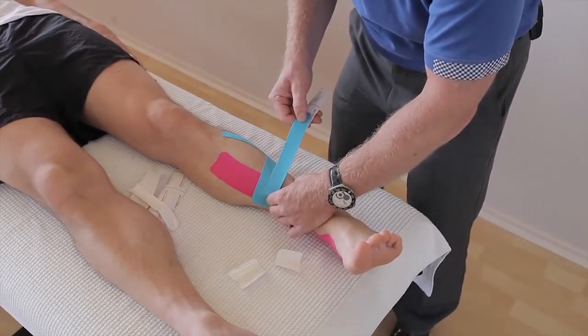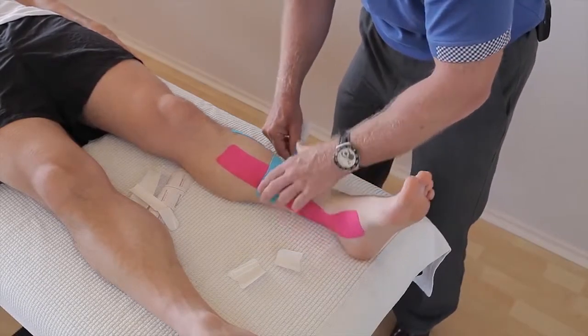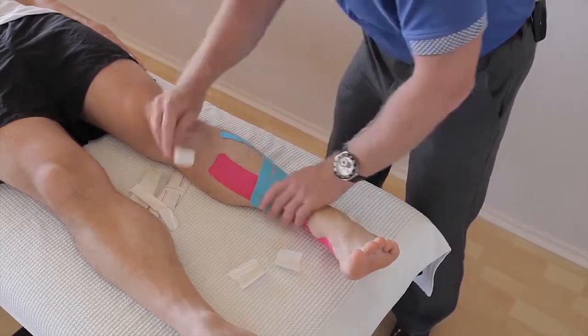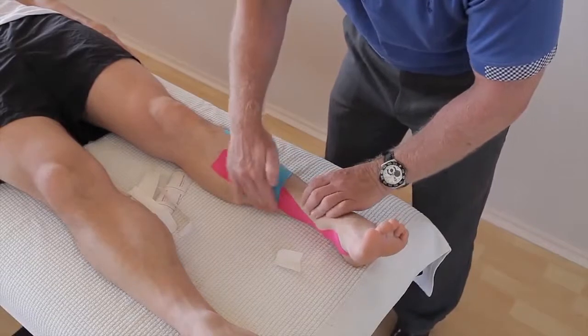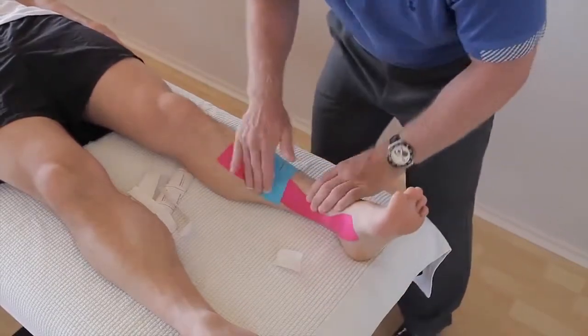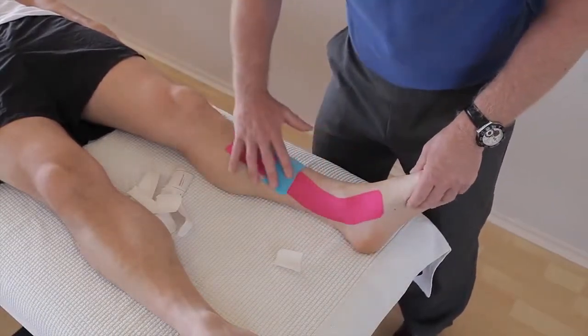So pull in the tissue, 75% stretch, and then as I bring it round, I can ease it off a little bit if I roll his leg that way, like so. Using the back of the tape, just to heat activate the glue, just to make it a bit stickier. And there you have kinesiology taping for any form of medial shin pain.